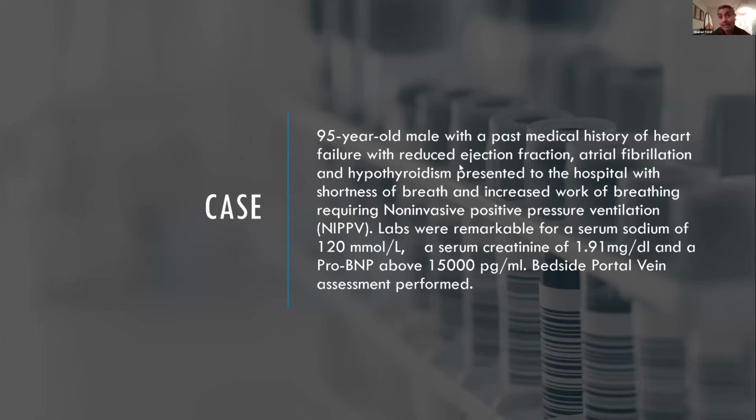You may have a dilated IVC, but you don't have portal vein pulsatility, you don't have monophasic renal vein, you don't have systolic flow reversal or diastolic predominance on the hepatic vein. And so that patient probably is chronic, and you wouldn't be doing much for them beyond just managing their pulmonary hypertension. But if they have an acute exacerbation of whatever their physiology is, you probably are going to get that pulsatility, and you probably want to diurese that patient as well. Thank you. We don't have any more questions for now. I think we can continue.